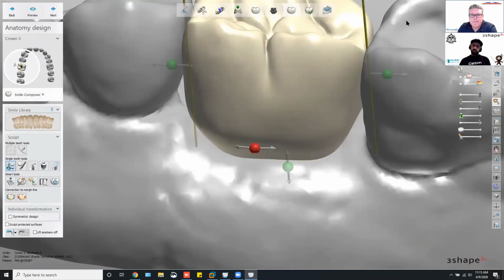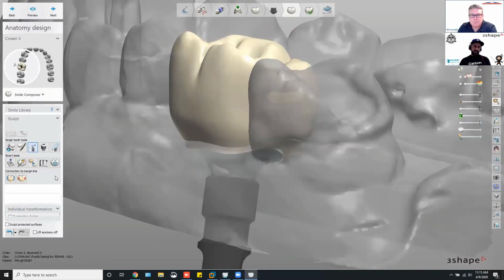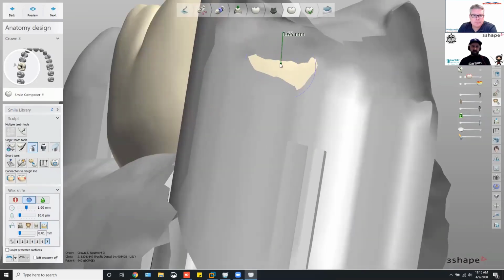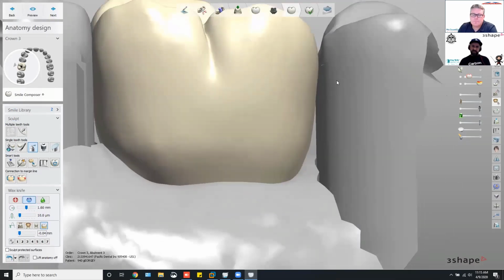And then the other thing is the contacts. Like I said, knowing your tools is key. So if I come here and do my undercut, a little like that, that's what I'll set to 1. So they'll go -4. And I come here, I can do this. It's actually going to stop it. When you see here, this is going to be your undercut.